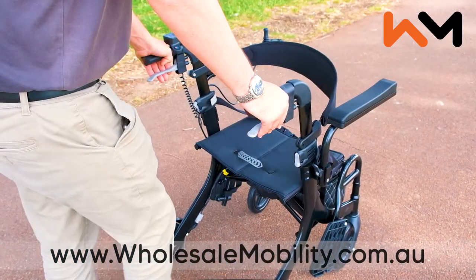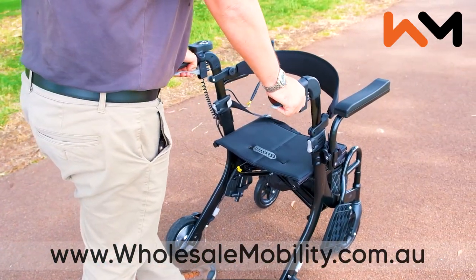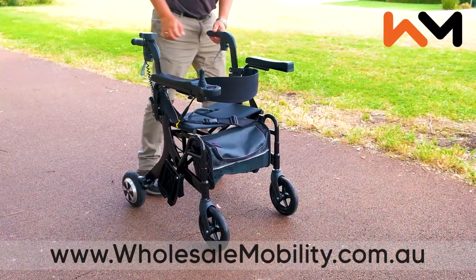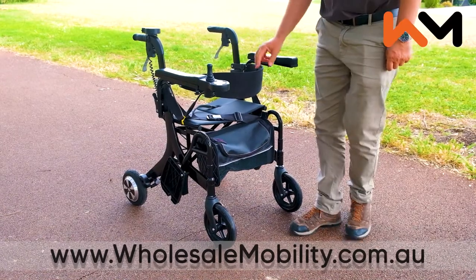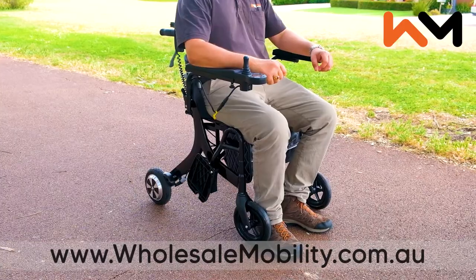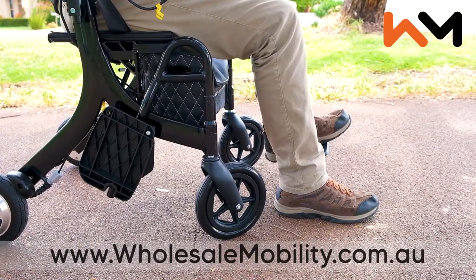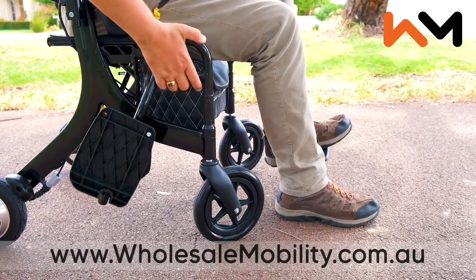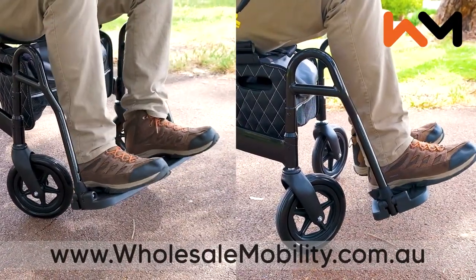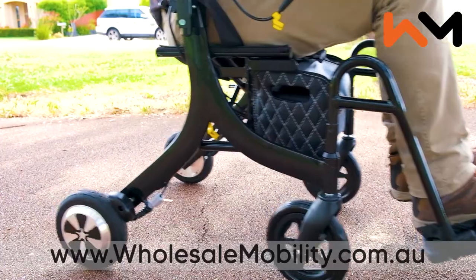Converting the Evo from a rollator to a push assist wheelchair or electric wheelchair couldn't be easier. Ensure your manual brakes are engaged, flip the backrest over and swing your footplates into place. This is done by lifting them up and then swinging them to the front until they click in.